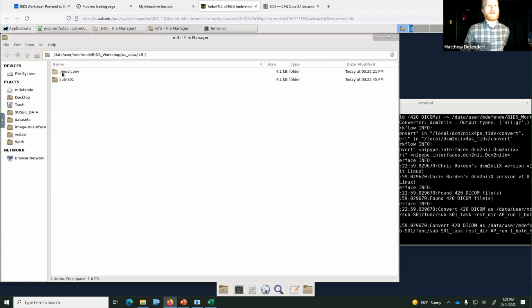You can regenerate the BIDS formatted version very easily, as long as you have the heuristic file that was used for mapping, as well as the original DICOMs.